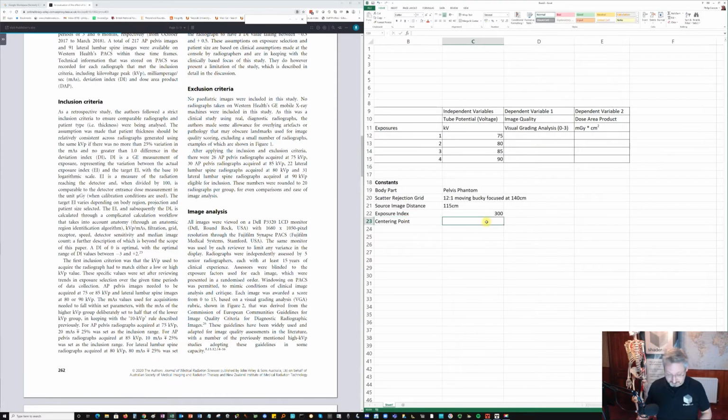And that's going to be between the pelvic symphysis pubis and iliac crests in the midline. Maybe that would do. You can look it up and pick.